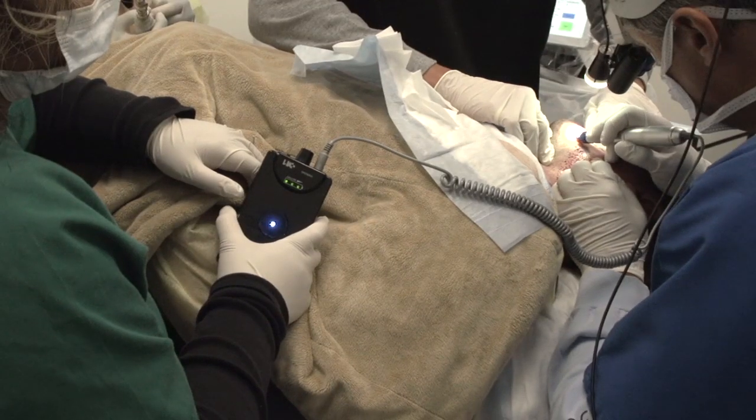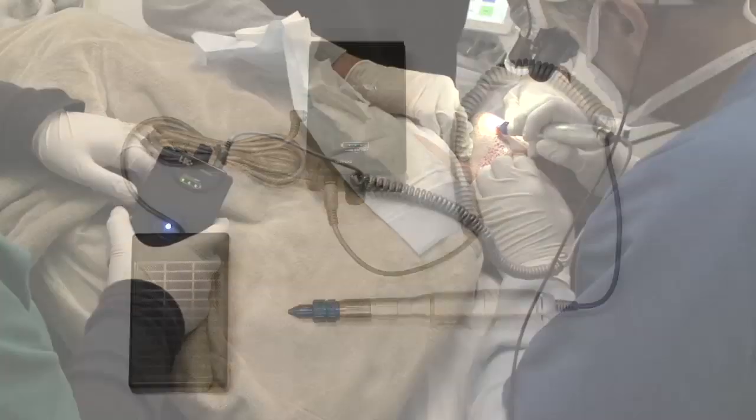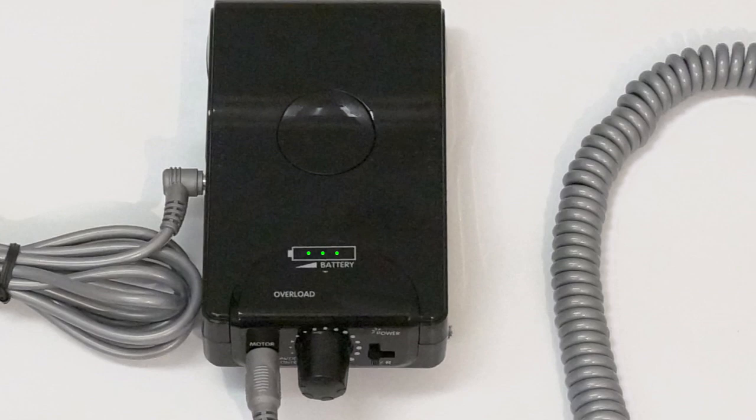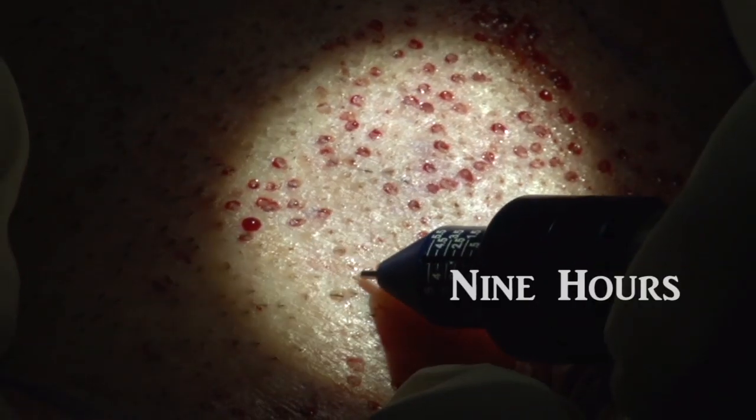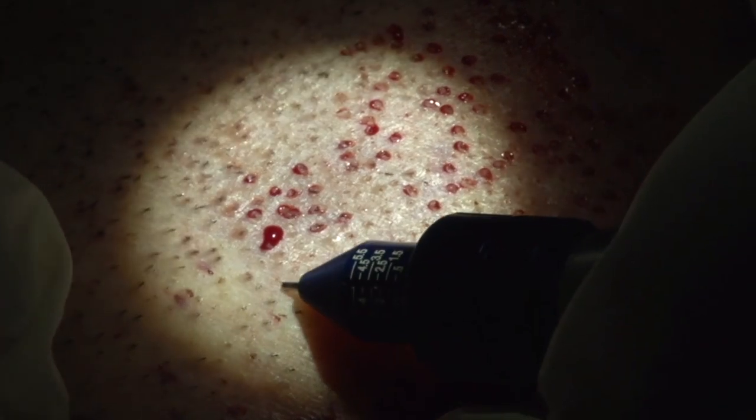The Vortex operates with forward and reverse motion with minimal vibration. It features a battery power indicator and operates up to 9 hours between charges. For recharge, it only takes approximately 2.5 hours.